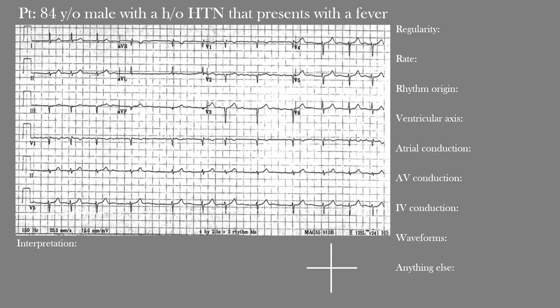Now I want you to pause the video and take a few minutes to go through it yourself. When you're ready, start the video and we'll go through it together. So our 84-year-old male with hypertension presents with fever, and he has this EKG. First off, what is the regularity of this rhythm? On first impression, the rhythm appears quite irregular throughout, meaning we're dealing with an irregularly irregular rhythm.